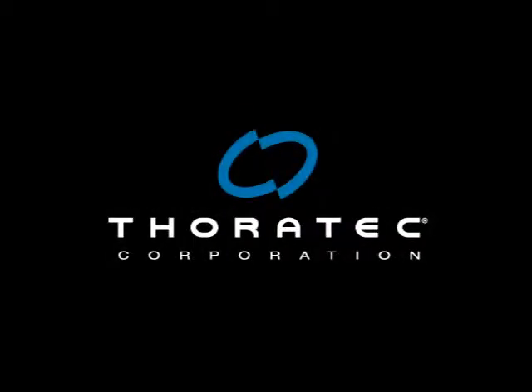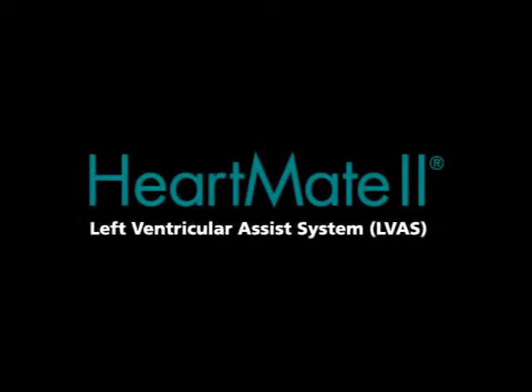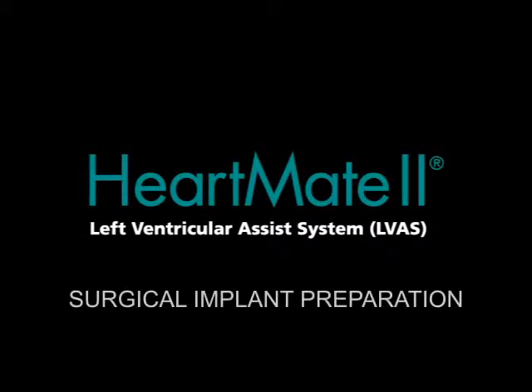Welcome to the HeartMate II Left Ventricular Assist System Surgical Implant Program. This section of the program will provide an overview of the steps involved in preparing for a HeartMate II Surgical Implant.